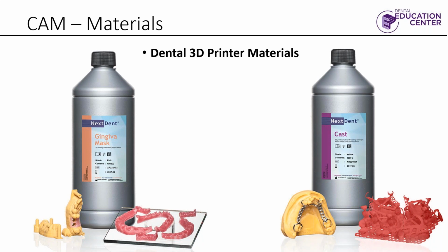On some of the more expensive printers, you can actually control the rigidity of your gingiva, but if you want to stay at $10,000, $15,000 for a printer, which is what I recommend for getting into printing, which is what the 5100 is. This is really still new technology, and I don't know if I'd feel comfortable jumping into a $50,000, $100,000 printer, but they are available, and those more inkjet, really cool printers let you control the density of the gingiva material for your implants.